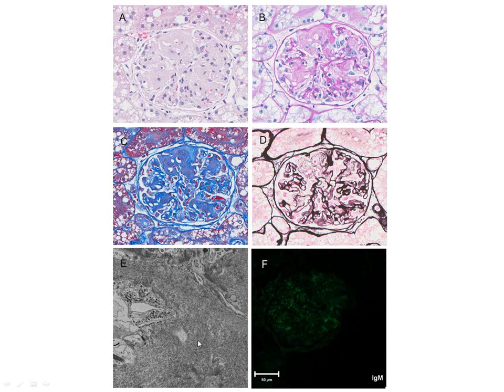Yes, and I apologize. For boards there would be an inset that would be a higher mag. I meant to do that and then forgot to do it, so I apologize. But I think here you can get a little more impression that that's more fibrillar. Yeah, like here you can see one fibril there. So fibrils, and then the IF, no, I'm not very comfortable with IF, so I would say based off of the EM that this is a negative.